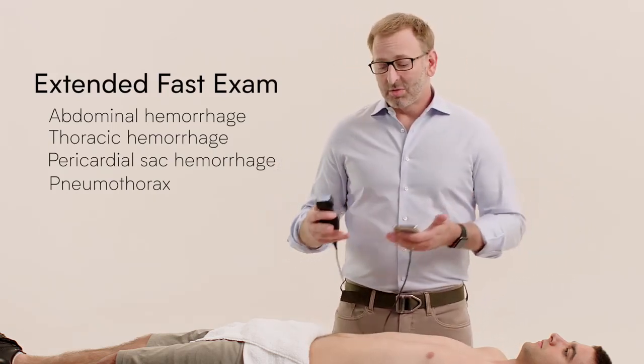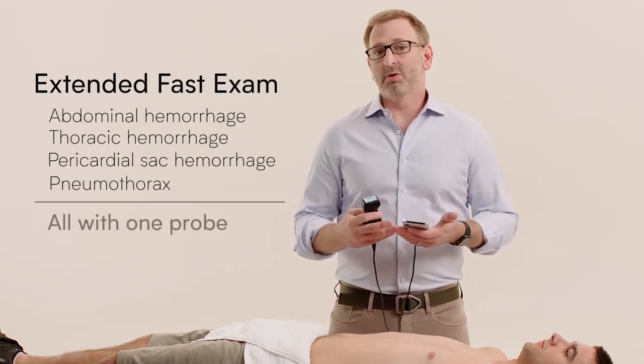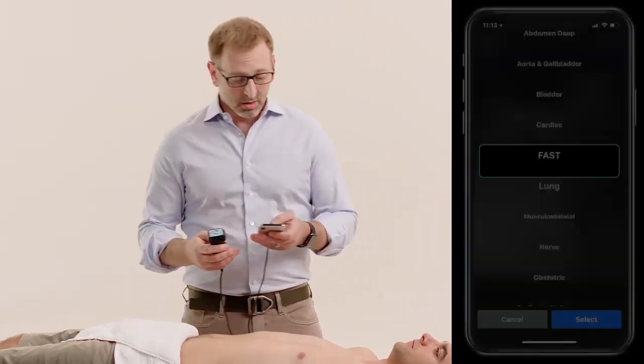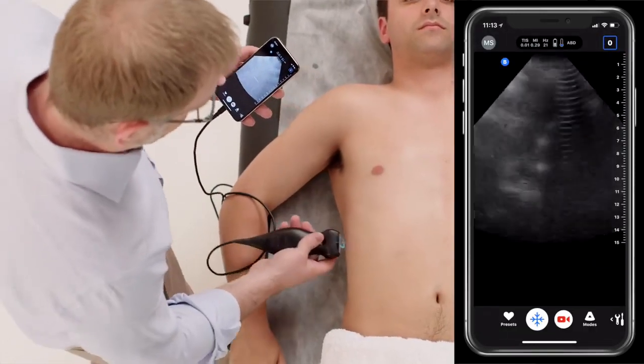Traditionally, assessing the abdominal cavity, the pericardial space, and the lung involves switching between 3 different transducers, and I'm going to show you how with the IQ you're able to evaluate all of those spaces with a single transducer very rapidly. So we'll start off with an abdominal preset, and we'll look in Morrison's pouch.